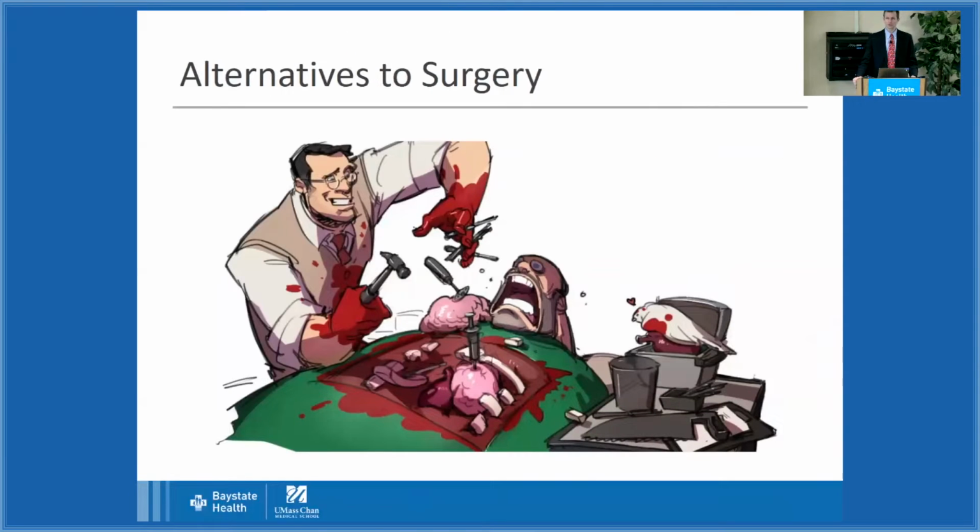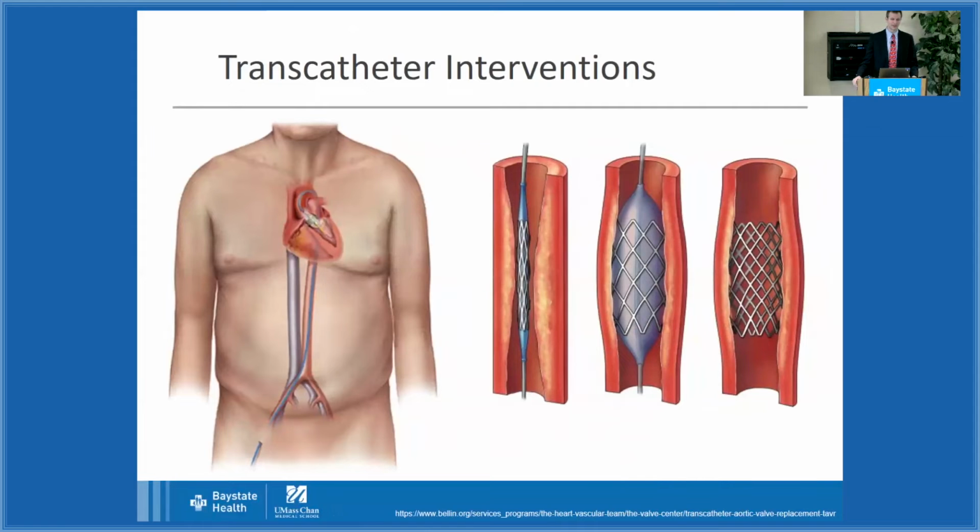Most of the procedures we'll be speaking about today are alternatives to surgery. Open heart surgery is a tried and true methodology. Many people would prefer to avoid open heart surgery if minimally invasive options are available. And open heart surgery is something for which many people are not candidates due to medical illnesses, advanced age, inability to tolerate. So today, we're principally going to speak about transcatheter interventions.